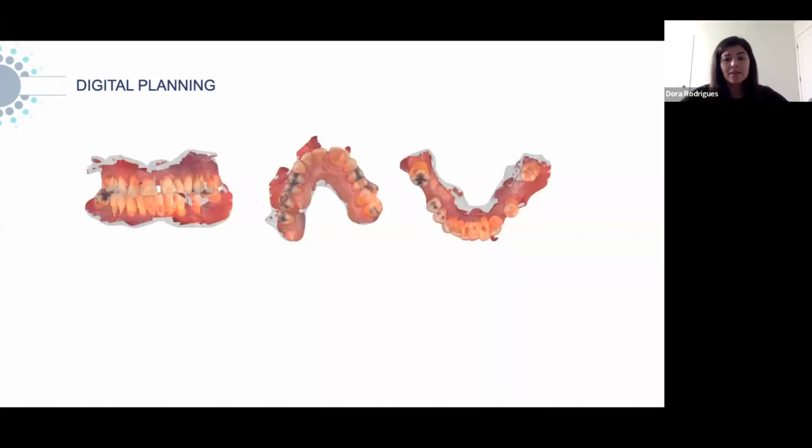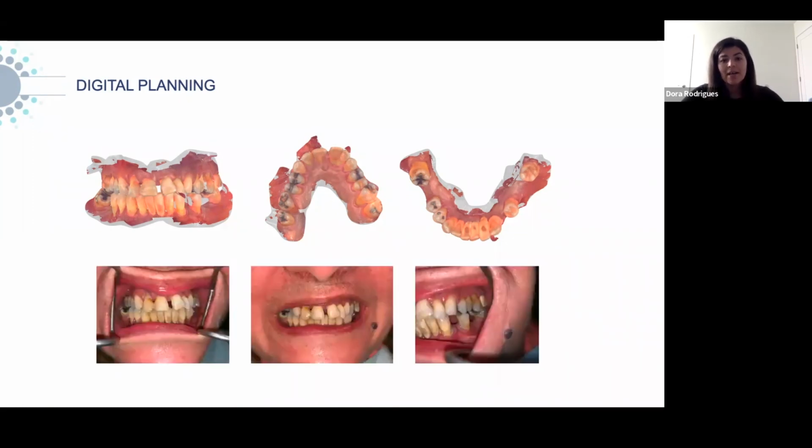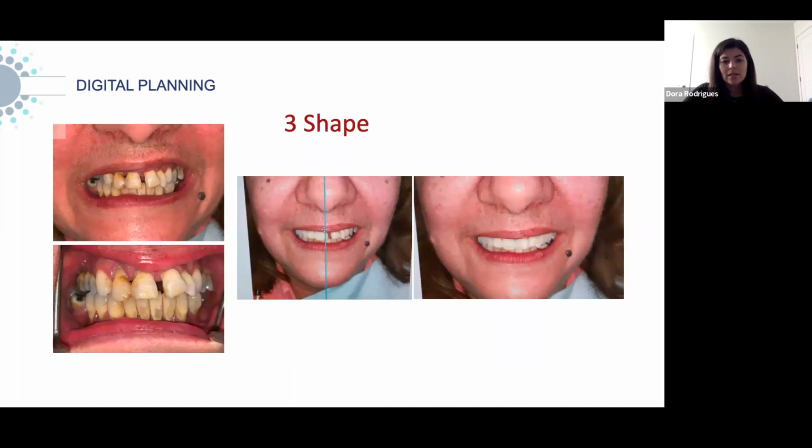So again, this is the very first case that I received. I got the photos at the time. I didn't even have a proper software to open the STL files, and I freaked out because I had no clue what to do with them. And honestly, I just called my friend, and said you have to do this case for me because I don't know how to get started. And along the way, please explain to me what I need to do to start designing visually. So he used 3Shape, and these are the photos that I got from the patient. He started doing the visual design with the photos of the patient.